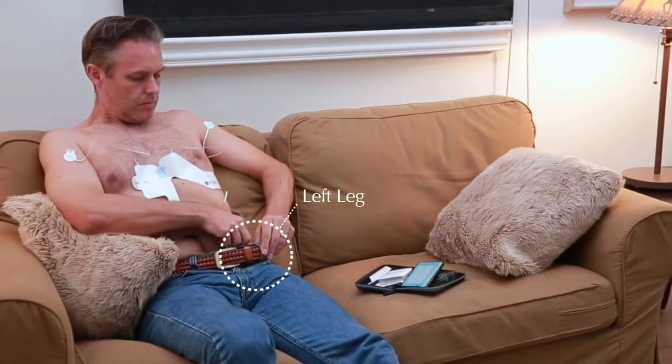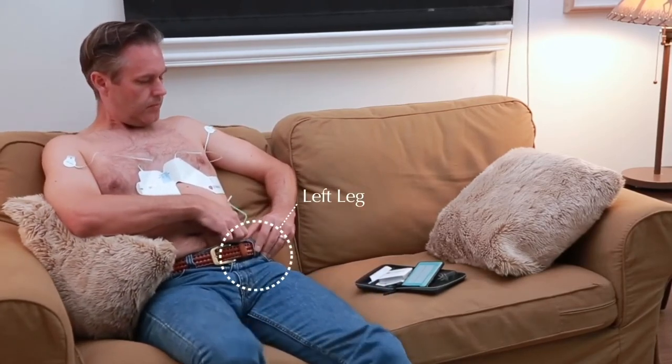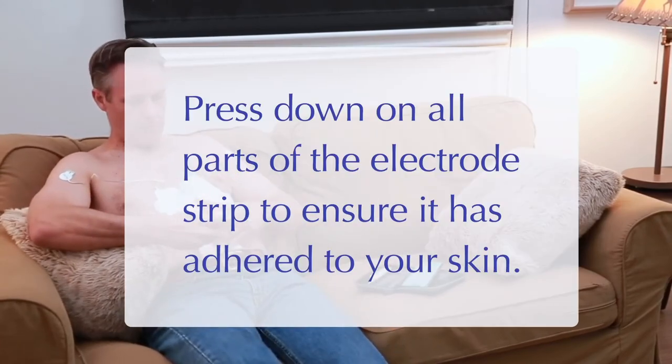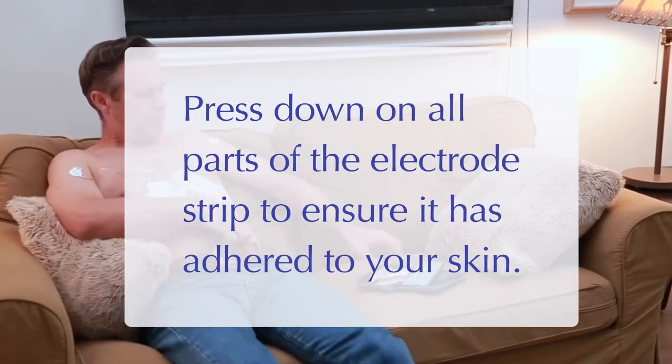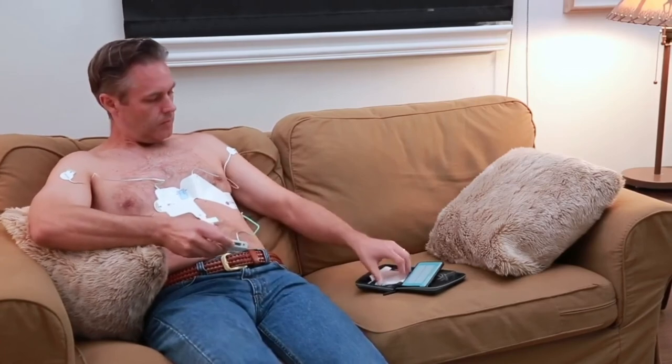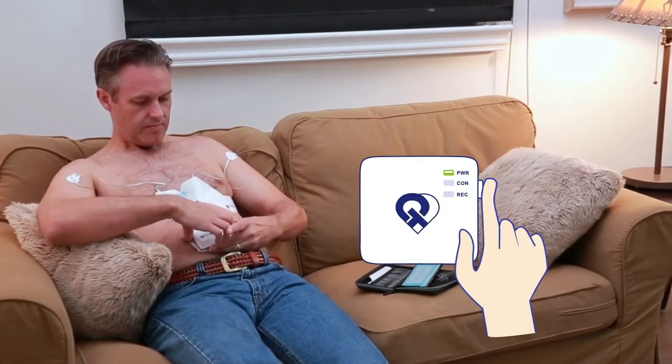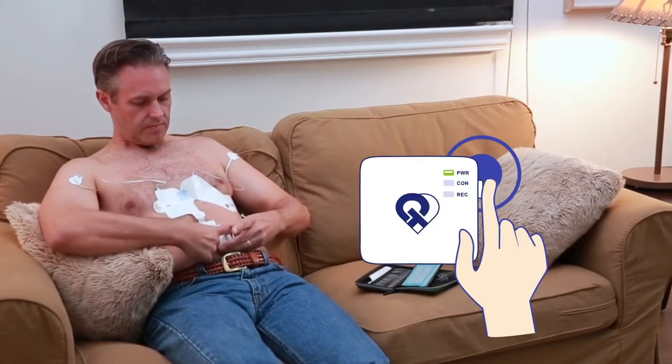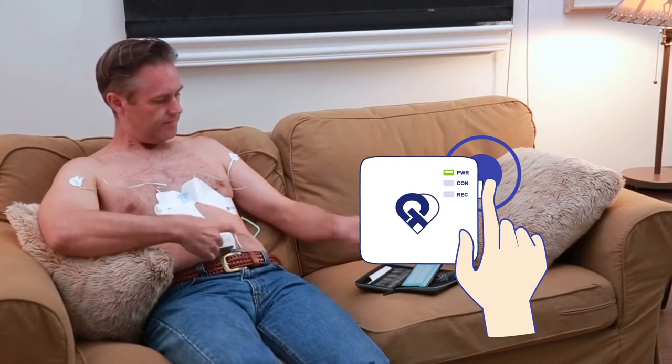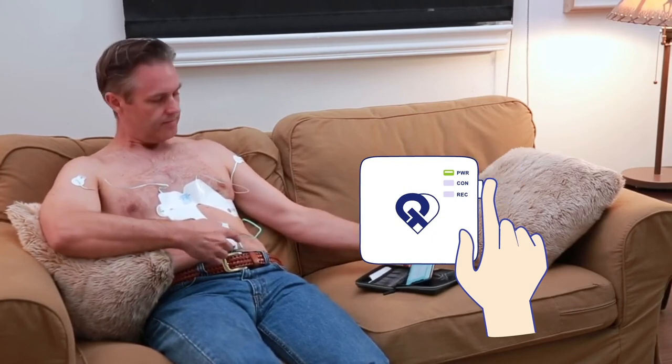Press down on all parts of the electrode strip to ensure it has adhered to your skin. Place the piece of gauze provided between the recorder and your skin. Turn on the PCA 500 recorder by holding the power button down until the lights on the front begin to flash. Connect the recorder to the electrode strip.